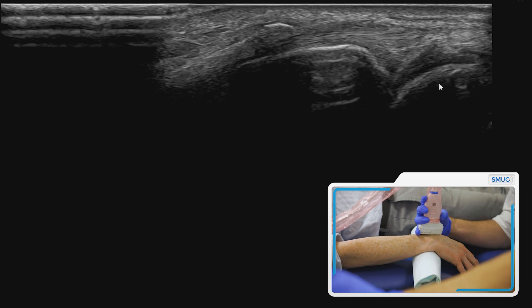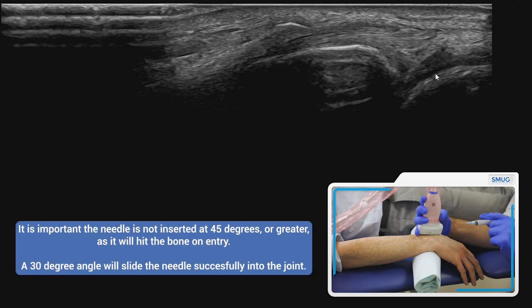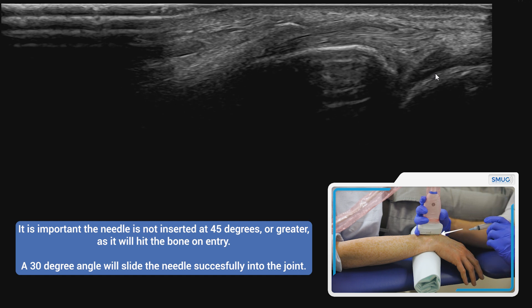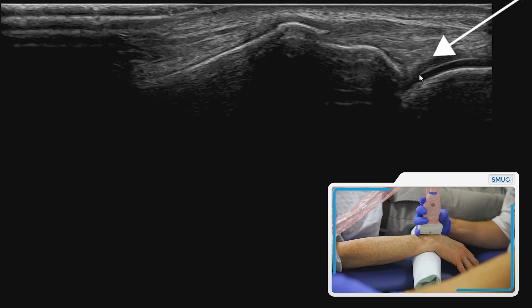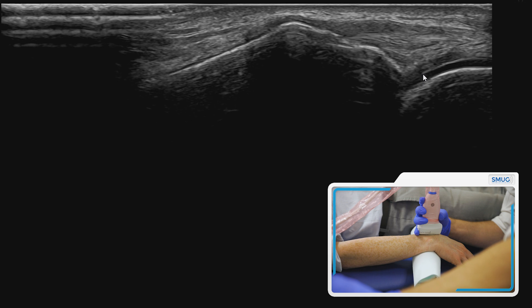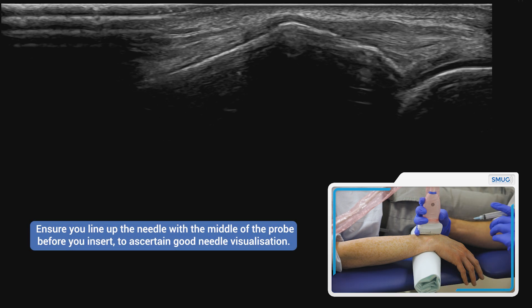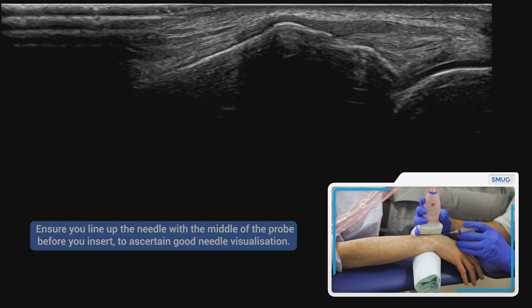It's important because we've got the bone here that we don't go at too much of a downward angle. What we're going to do is start the needle just a little bit away from the probe and slide underneath at around 30 degrees, and what we'll see very nicely is the needle tip coming down here. It's important that we see not just the needle itself but also the needle tip, because that's where we're going to inject the joint from. So we'll line up with the middle of the probe and go in at about 30 degrees.